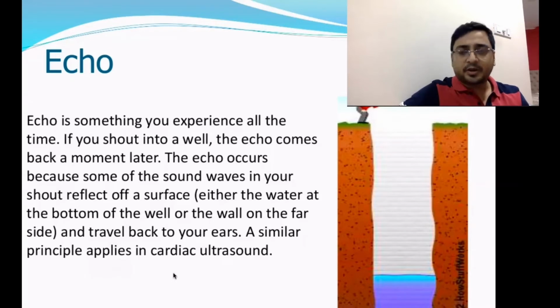And this echocardiogram has now become one of the most important diagnostic tools in cardiovascular examinations because most of the time it can diagnose a lot of disease, structure wise, functional wise, and can help to guide the treatment approach.